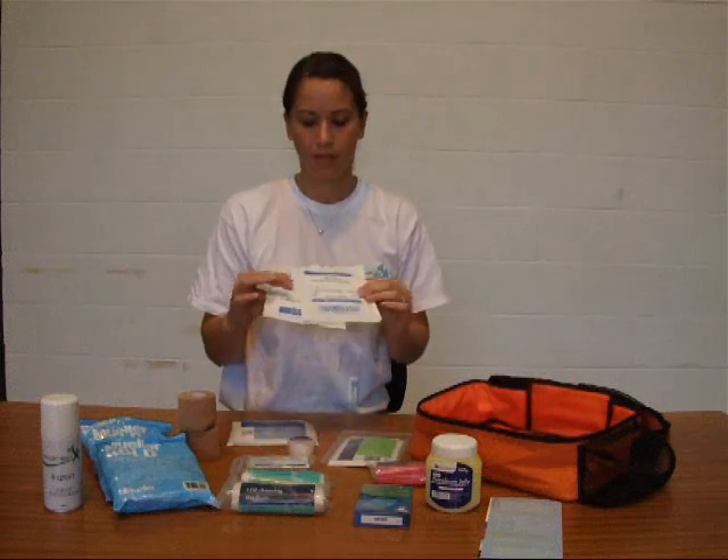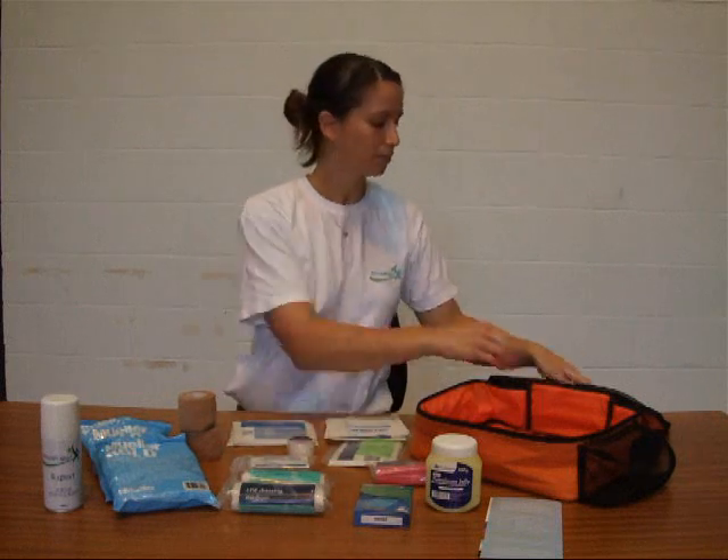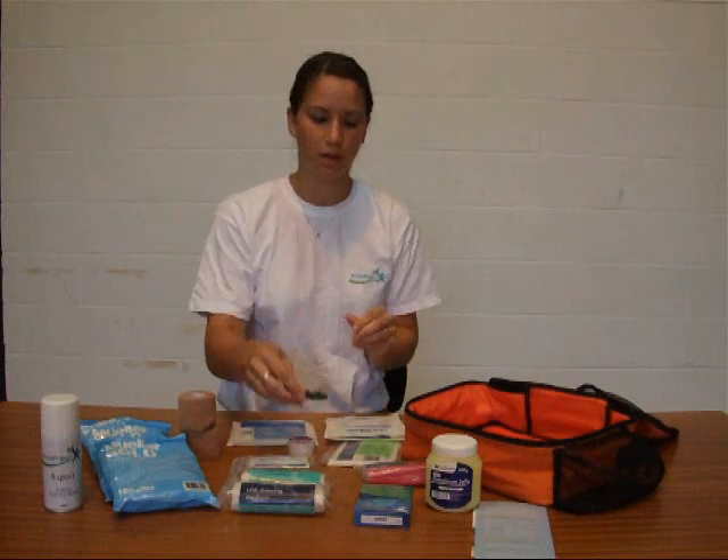We've also got some sterile swabs, just for mopping up any blood or anything like that. In our top pocket we've got some scissors with two blunt ends so you're not likely to puncture anybody's skin.